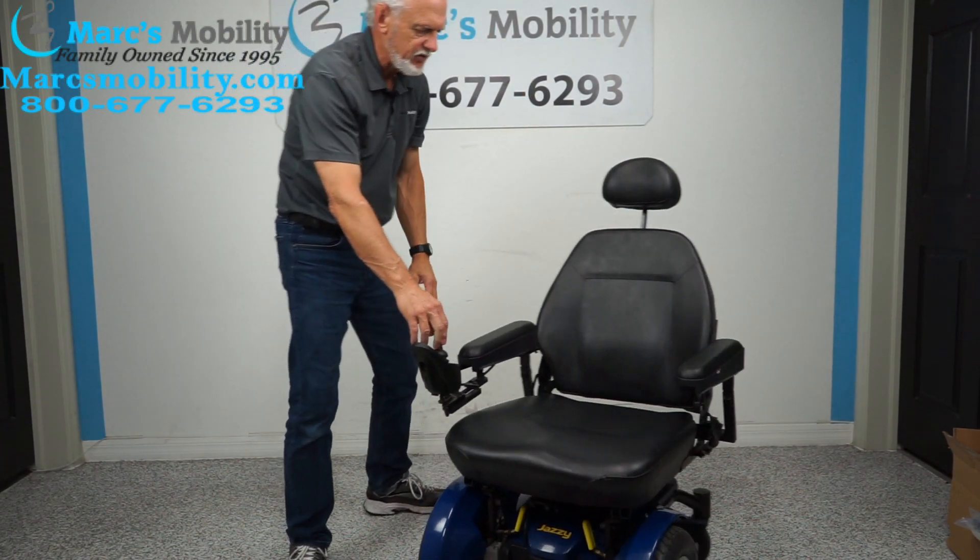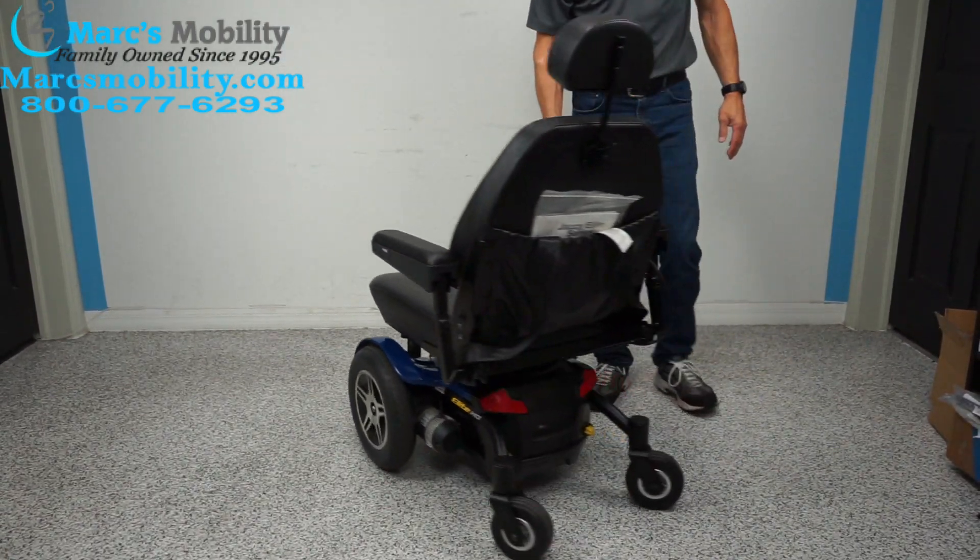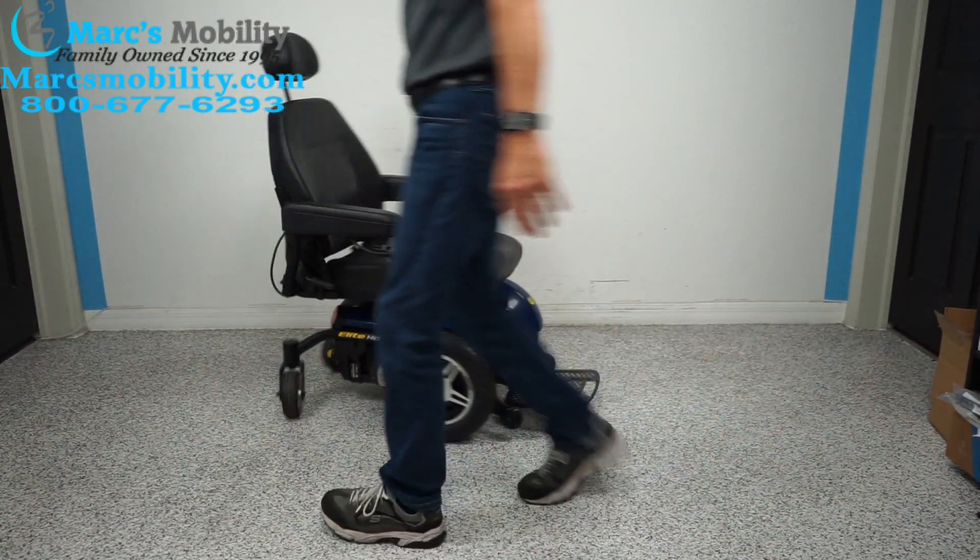This is your turning radius on the chair if you're inside the house and you need to turn a full circle — that's what it looks like.